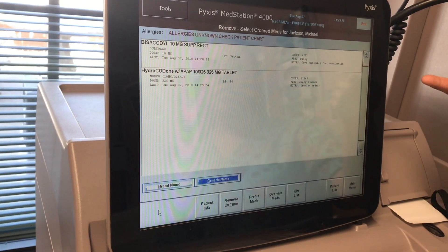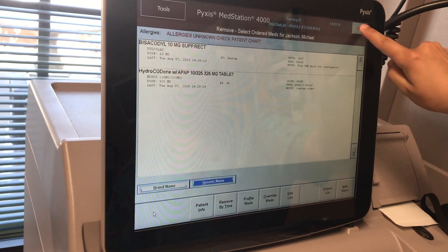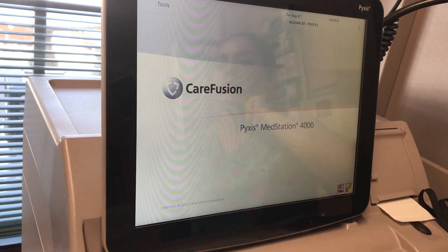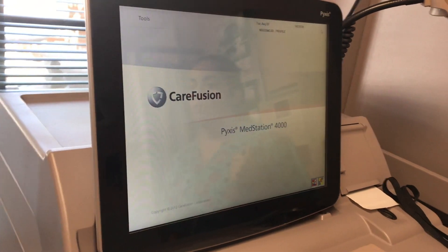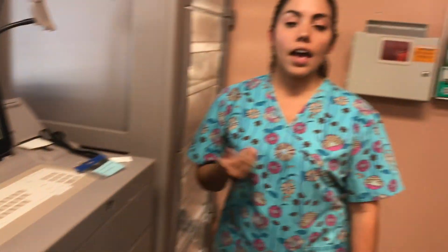At this point I will click Exit. And I have successfully signed out of the MedStation Pyxis.